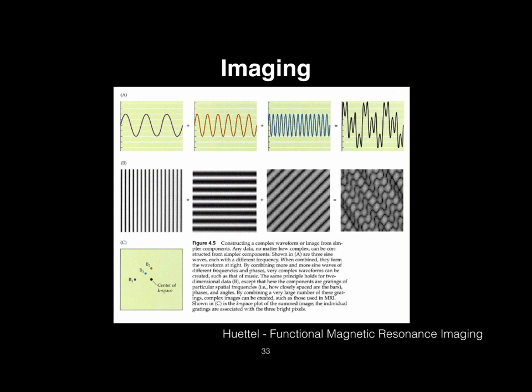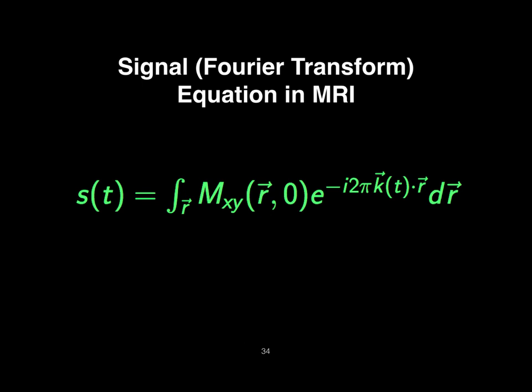If you actually go into the math, these end up being equivalent things. So it's kind of arbitrary how we name the encodings, but it was a simplification in the beginning to differentiate the two dimensions and how they were detected, essentially. Thank you.